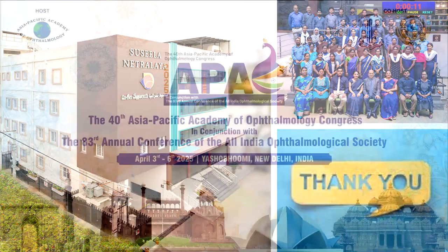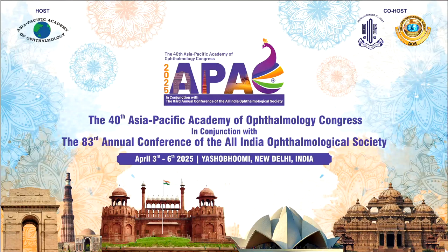Nice presentation. Do you look at the anterior float of the planned ablation to what is the present defect on the individual's cornea, and do you see whether these two are in alignment in your protocol? Sorry, ma'am, I didn't get the question. Like in a topo guided treatment, what we do is we look on the anterior float map, the kind of ablation pattern which is going to happen to the original defect which is there, and we see whether the two are getting aligned. Yes, ma'am, we do that.